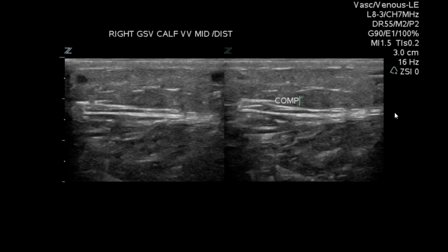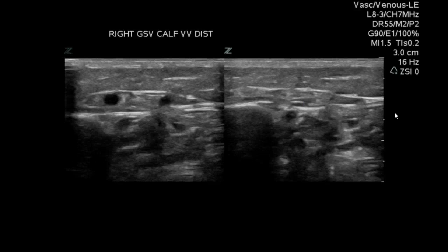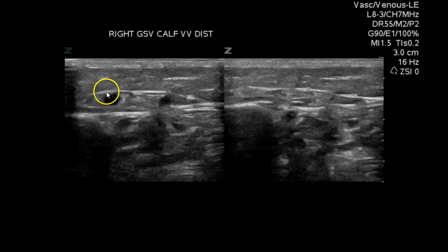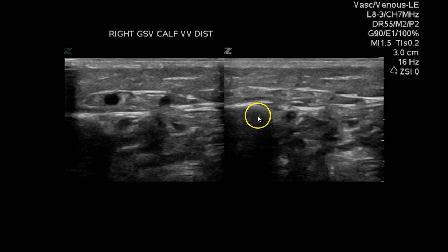Moving to the mid-distal calf, these veins appear to compress, again, in the superficial tissue. And now we see what appears to be the true great saphenous — it's moved back between the fascia, and it is fully compressible.